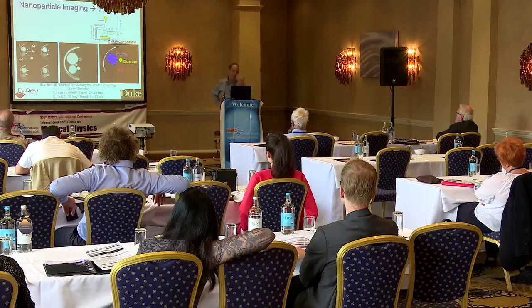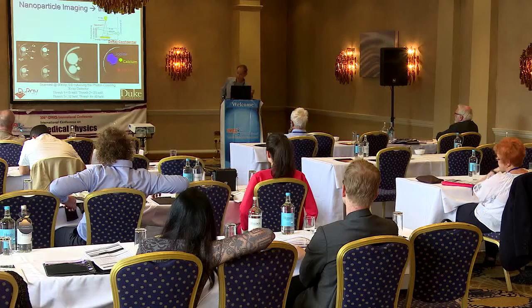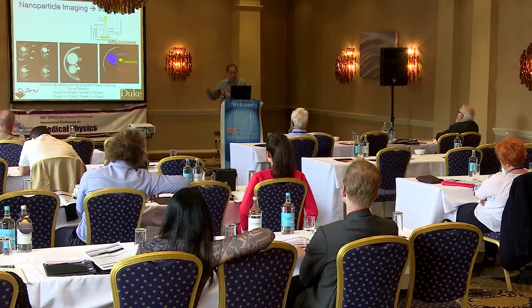encountered a lot of resistance in the industry to adopting this new technology. The major CT manufacturers have recently spent tens of millions of dollars developing new scintillators, like the gemstone scintillator that's used in GE systems. They do not want to just abandon this. They need to make back all that money.